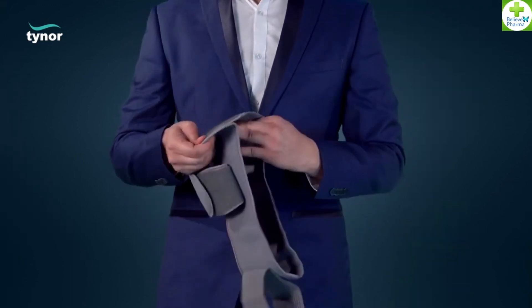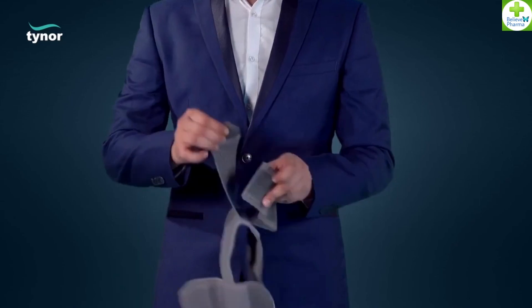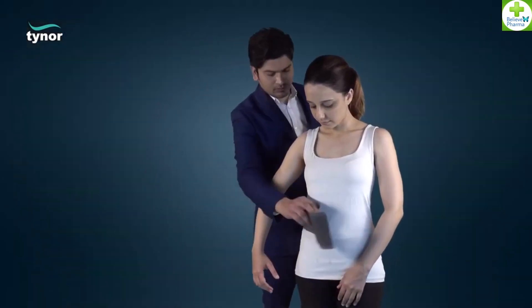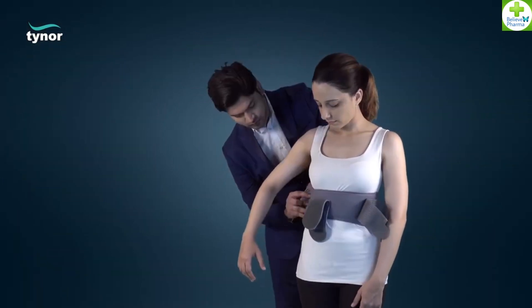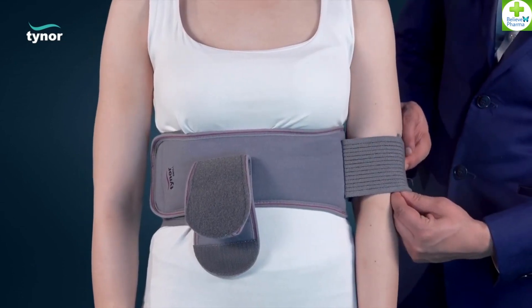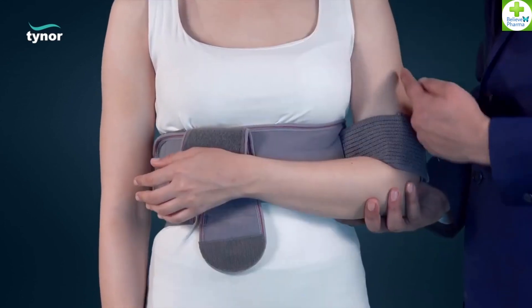Open the elastic shoulder immobilizer. The chest band is encircled around the upper torso of the patient. Wrap the arm and the wrist of the affected side of the patient.